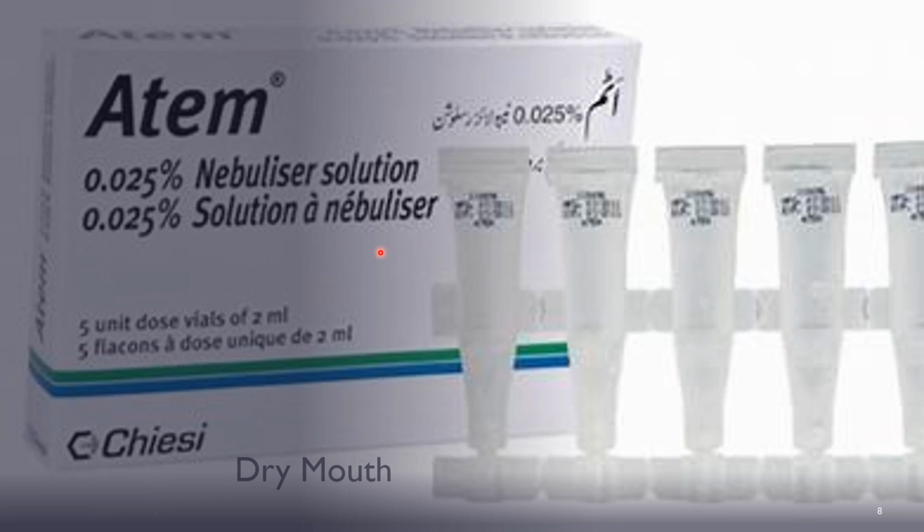So 2 ml solution contains 500 microgram of ipratropium bromide. You can nebulize with 250 microgram, half ampule, or one full ampule of 500 microgram, and diluted in the same concentration of 2 ml and 2.5 ml of normal saline. The most common side effect of ipratropium is dry mouth.